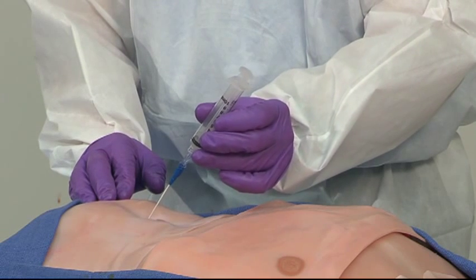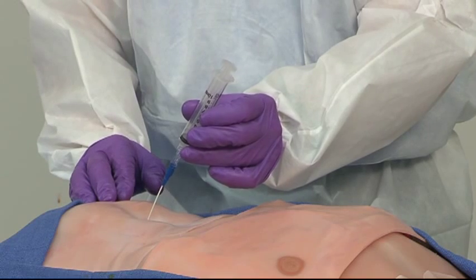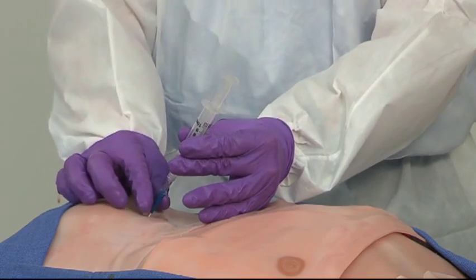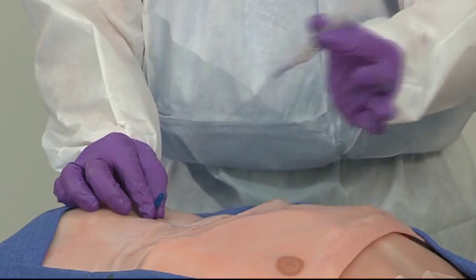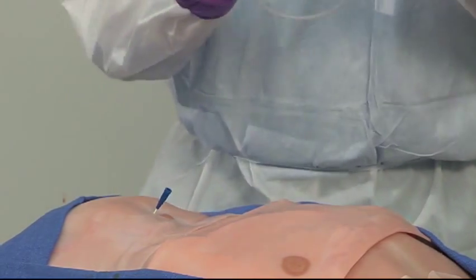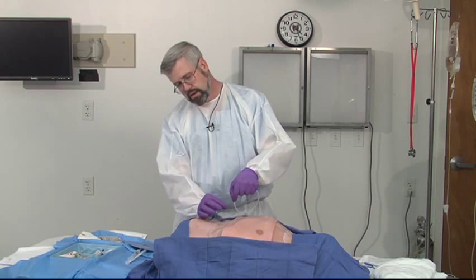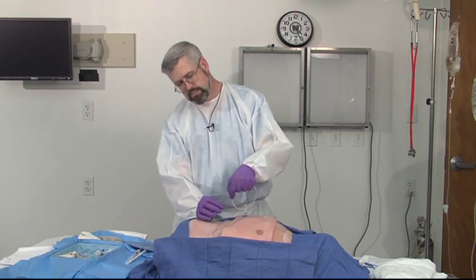You're going to feel a pop as you pop through the anterior fascia, and you're going to feel another pop as you pop through the peritoneum. You're going to then aspirate. I'm not getting anything back at this moment, so now what I'm going to do is pull the needle out of the angiocath and do the Seldinger technique using the wire. The wire is going to go into the angiocath — and it's going in nice and easily. If you meet resistance, you're probably not in the pelvis and this needs to be repeated.